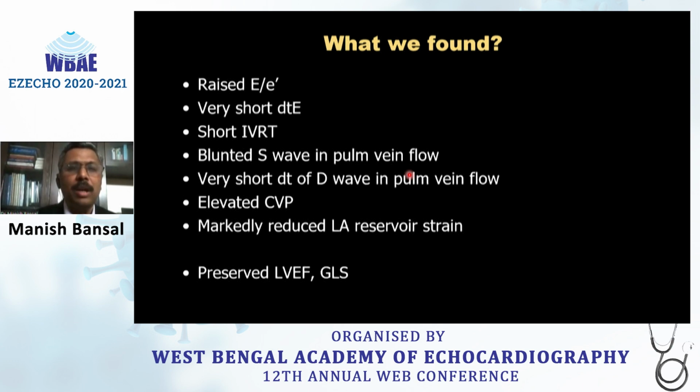Either the pathology affecting the heart has affected preferentially left atrium, and we are yet to see worsening of LV myocardial function with time. That seems actually to be the most likely possibility, but LA pressure is definitely highly elevated in this patient.